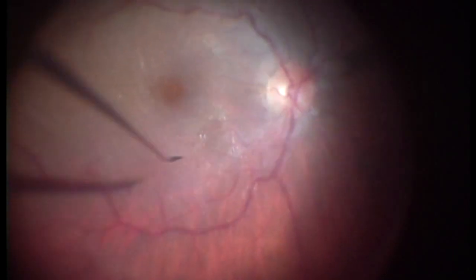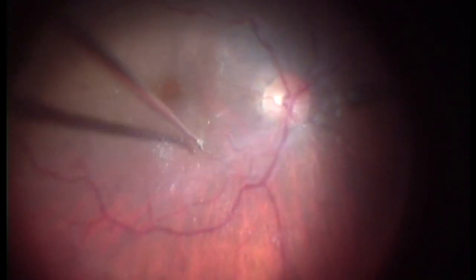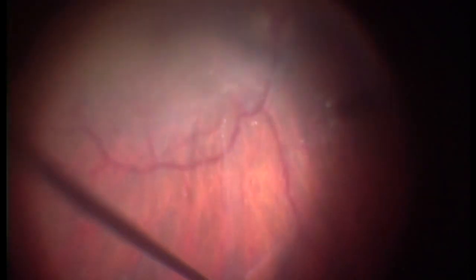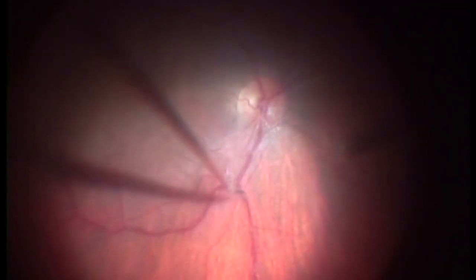Here, the taut posterior hyaloid is seen as a glistening reflex. PVD is induced by making an opening in the posterior hyaloid using a spatula. Since taut posterior hyaloid has focal adhesions to the underlying retina, use of high suction for PVD induction can lead to break formation. So this is a safer technique in such cases.